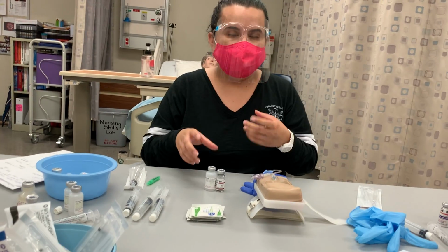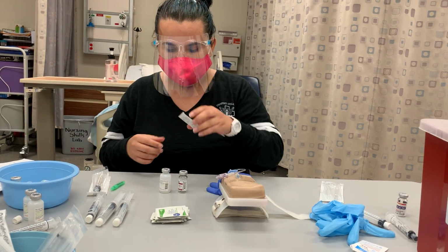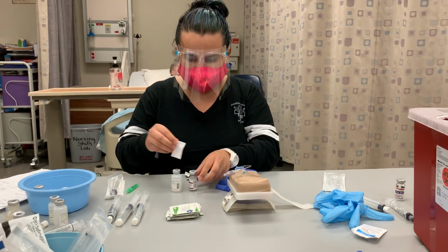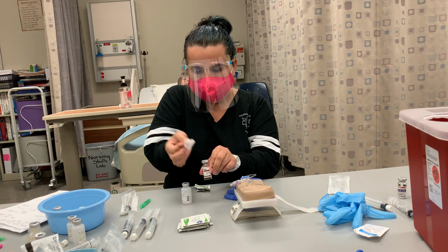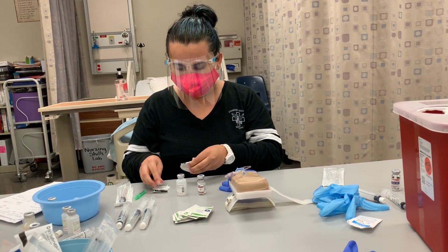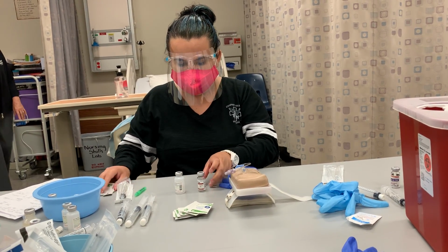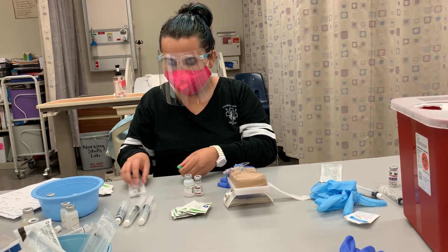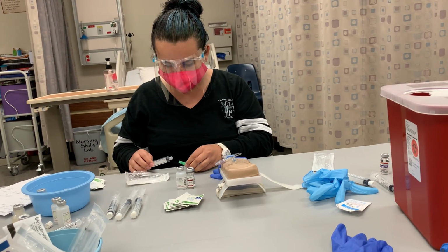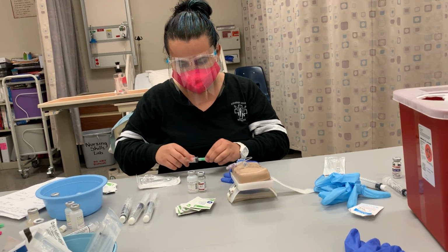So again, I'm going to do my 2 checks in the med room. I am going to grab my alcohol swab and do a quick swipe. Okay, this is trash. So now I'm going to attach my syringe to my 18 gauge needle as such, making sure that it's secured.